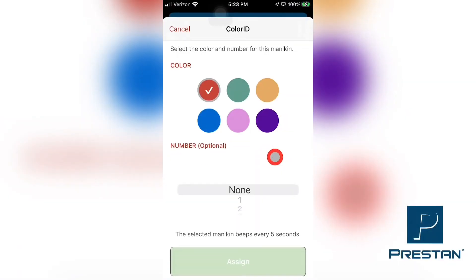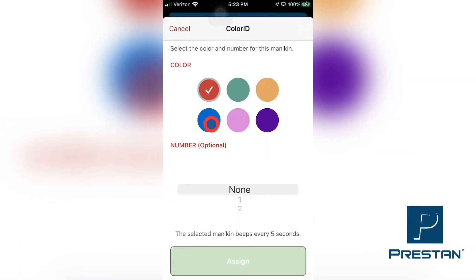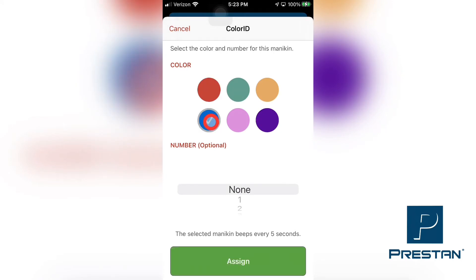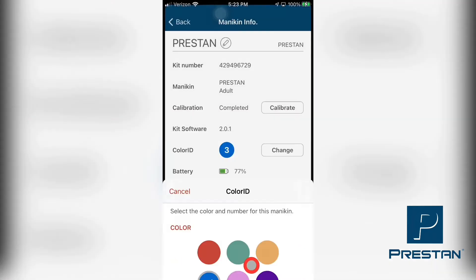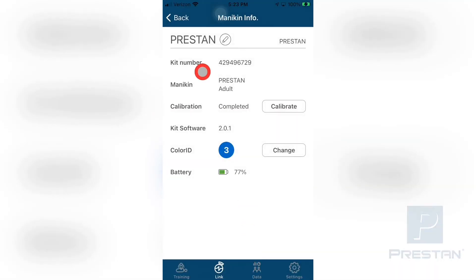Now, turning back to your smart device, select the corresponding color on the Preston CPR Feedback app by tapping on the appropriate color dot on the screen. Next, scroll through the number wheel on the app to select the corresponding number that has been assigned and affixed to the mannequin. Complete the process by selecting the Assign button on the bottom of the screen.